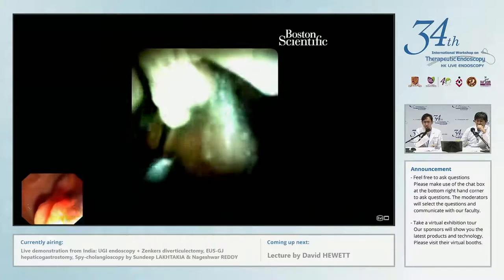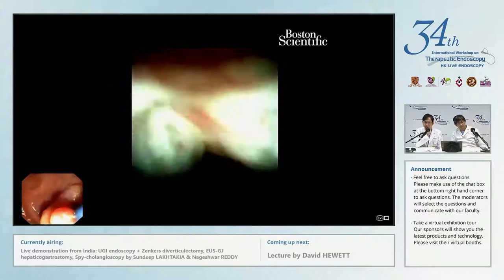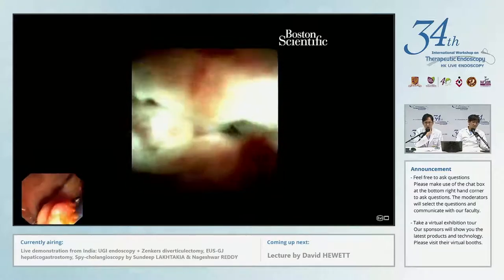Very nice pictures. Sometimes these are fascinating pictures. You keep watching them and forget what is happening to the other scope. Yes. The big scope. So you can see again here a very vascular pattern.